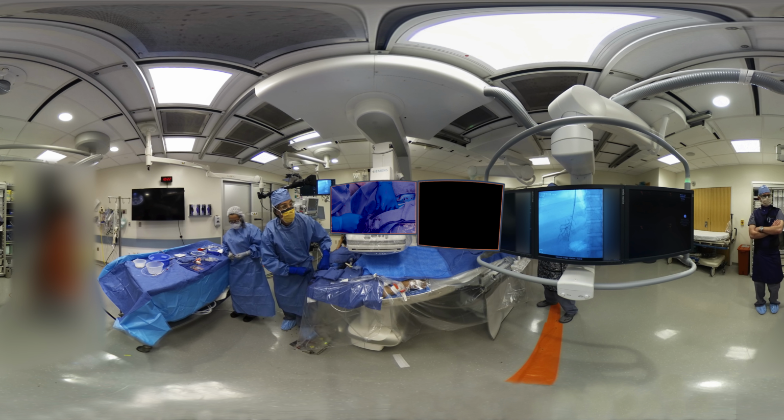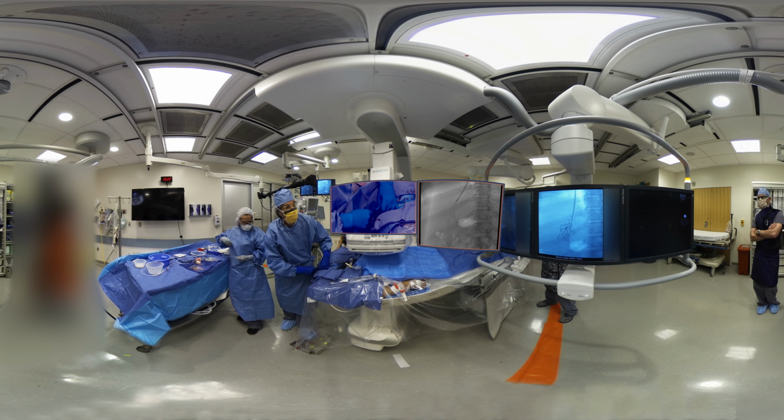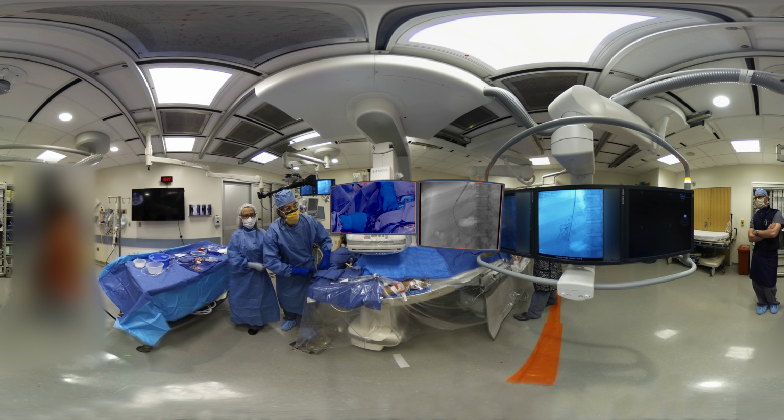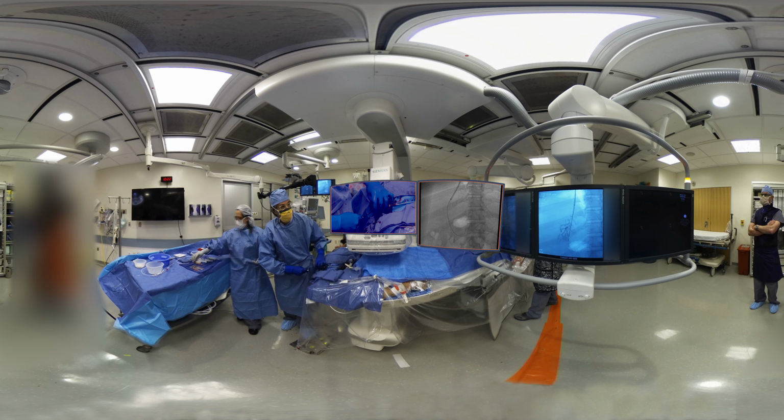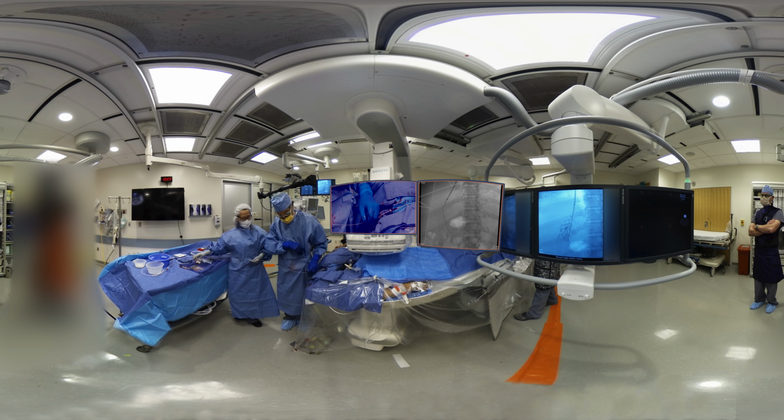Wire is there. And again, I'm going to leap across. I've worked hard to keep my sheath position, and I can see this device making the characteristic curve of the splenic vein. We can center a little bit more to the middle, show us a little bit more left. That's wonderful. And now I'm deep in the splenic vein, so we can remove the guide wire.